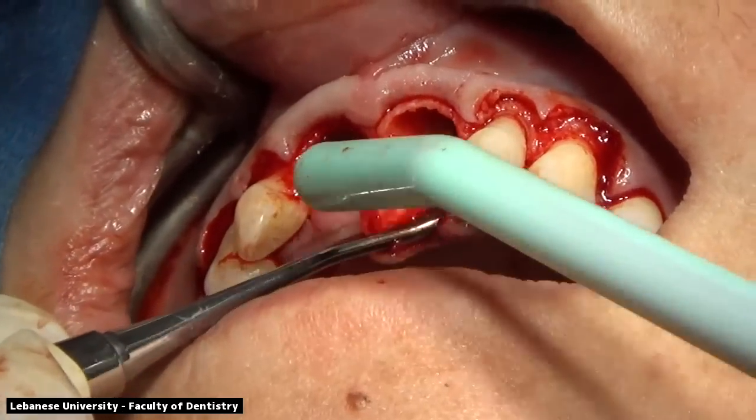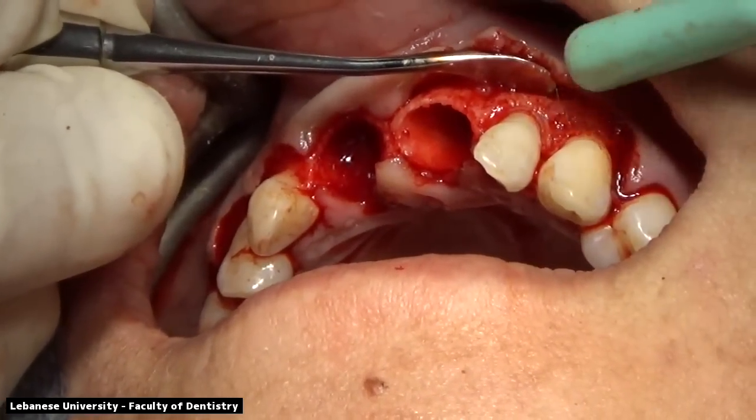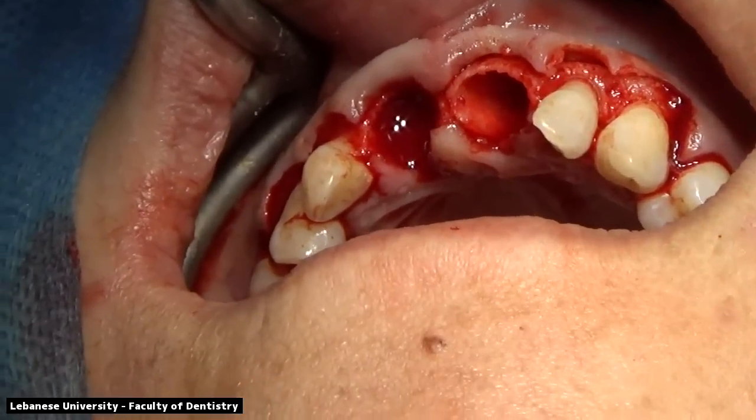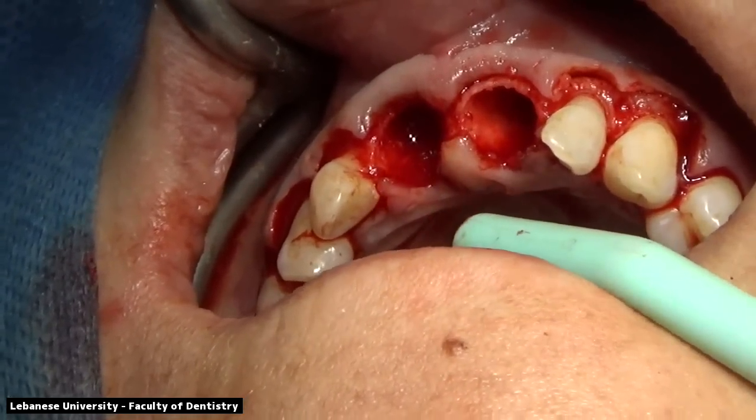Once we elevated the palatal flap, we can appreciate that the palatal walls are present, the buccal walls are present, and the margins of the bone are intact. There is thick buccal plate of bone on both the right and the left central incisors.